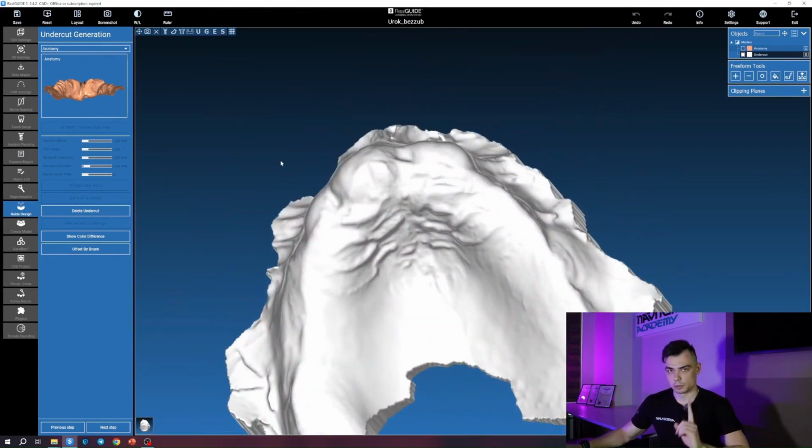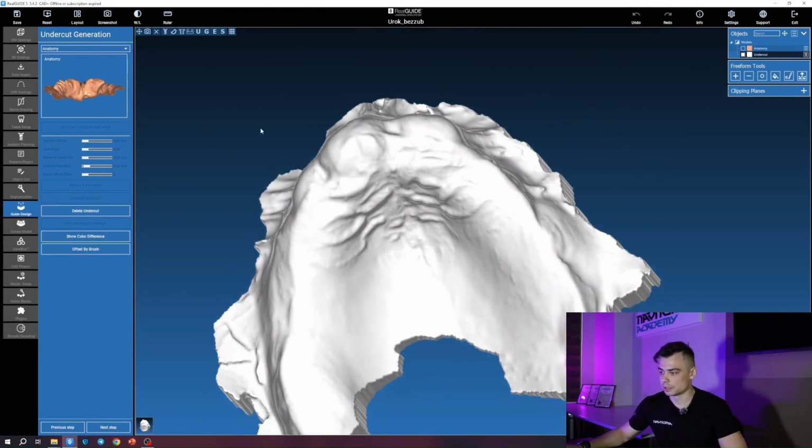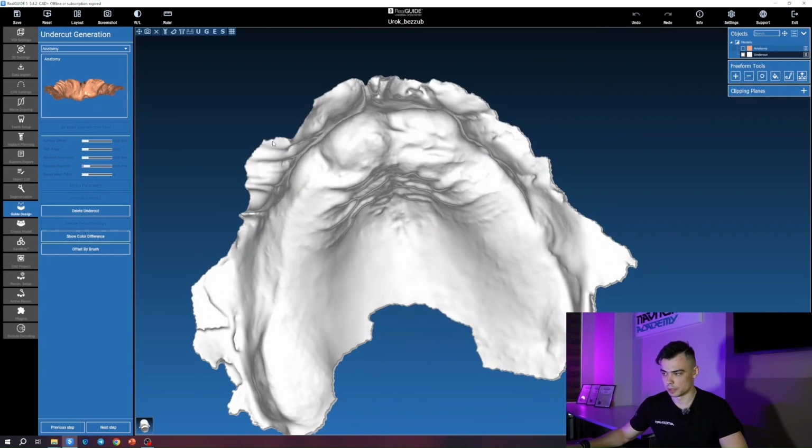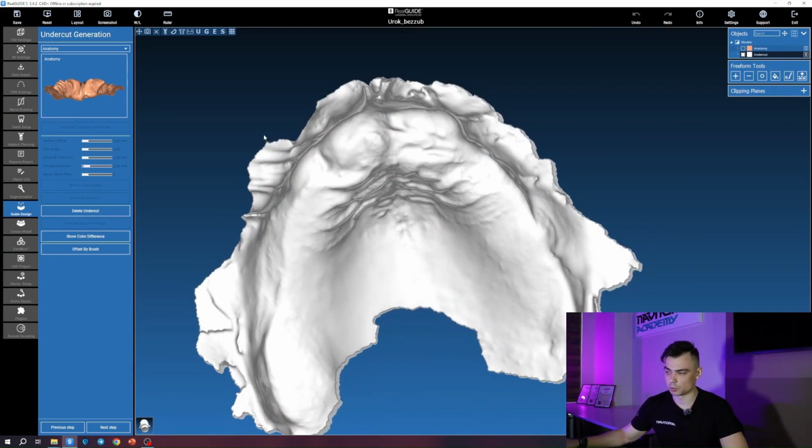Another important point, please pay attention to these edentulous jaws. It's not obvious to everyone, even for our colleagues we work with, and maybe you've encountered this problem too, that the mucosa can change its configuration. It's not as static a structure as, for example, tooth tissue, because a tooth, if it's intact and there are no issues, can go for years without changing its shape or position. Everything stays fine with it.